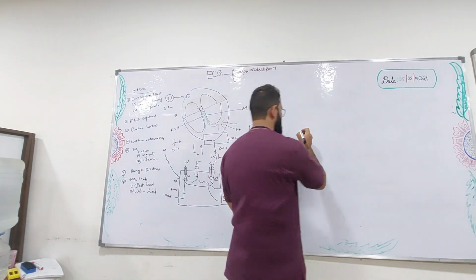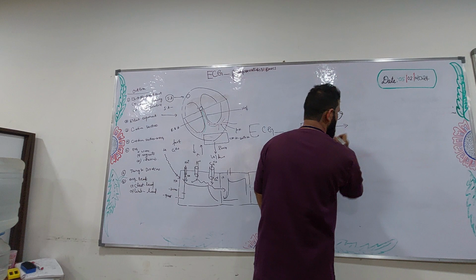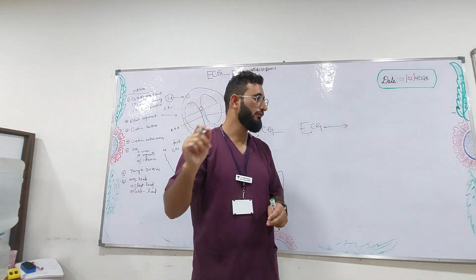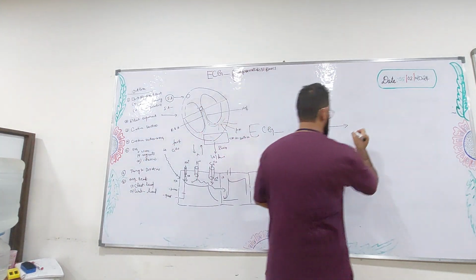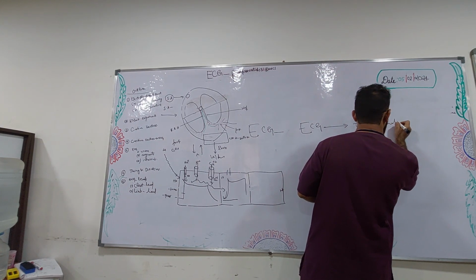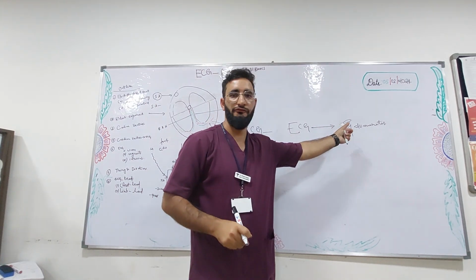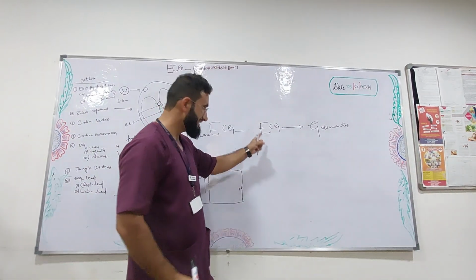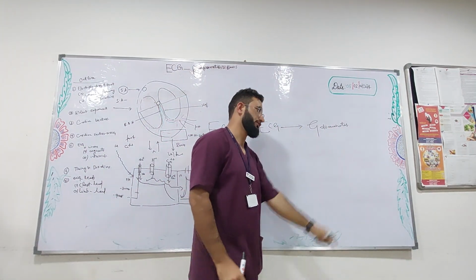Remember, the ECG machine works on the principle of, can anyone tell? Galvanometer, okay, galvanometer. What is galvanometer? You have heard this in physics in plus 2. So the ECG machine works on the principle of galvanometer.